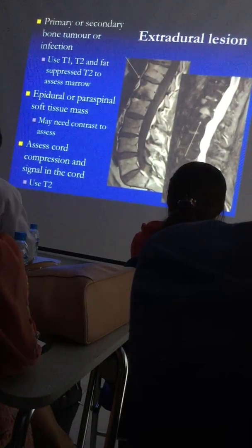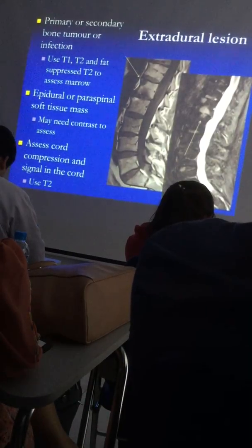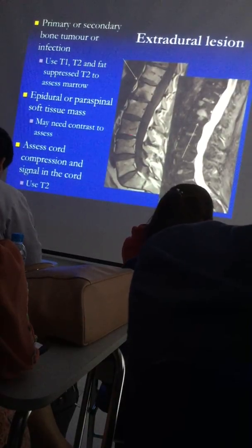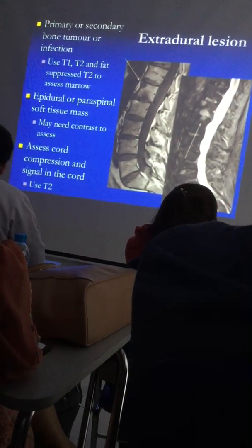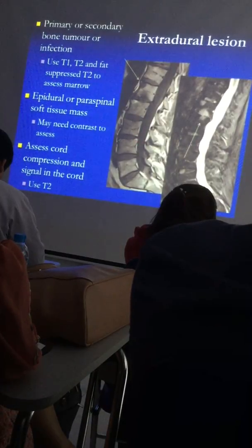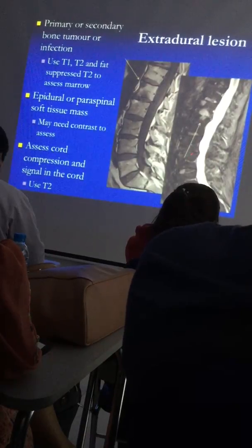You use the word Modic here? Yeah, okay. So I actually don't use that word, but what I do is I look at the end plates on the T1s. And if there is fat in the end plates, it's bright, like the fat is here. It's bright on the end plates. I think that's a Modic 2, and you can see it disappears with fat suppression.